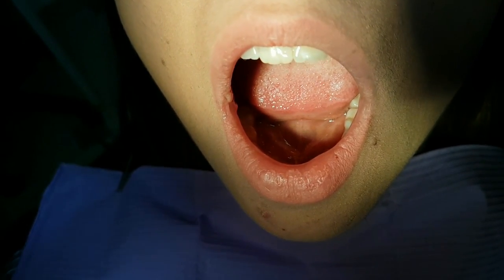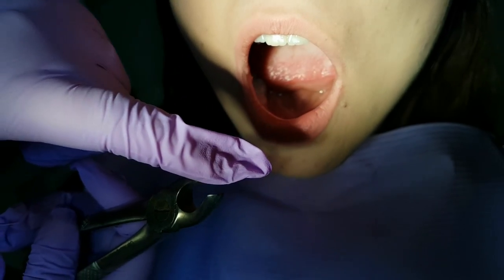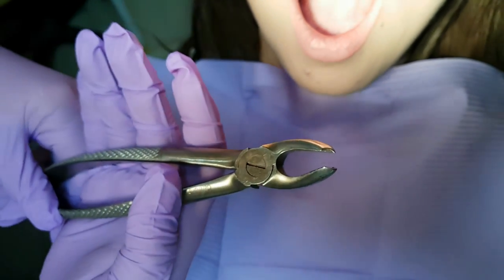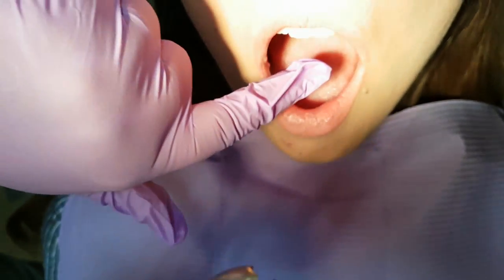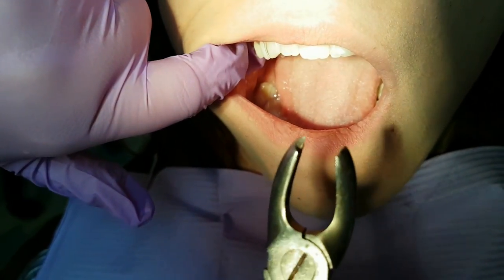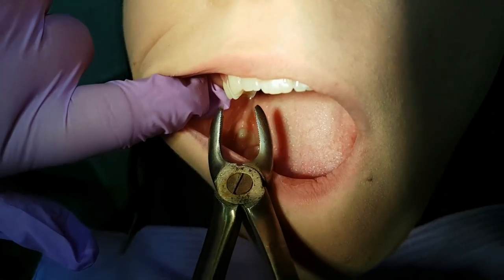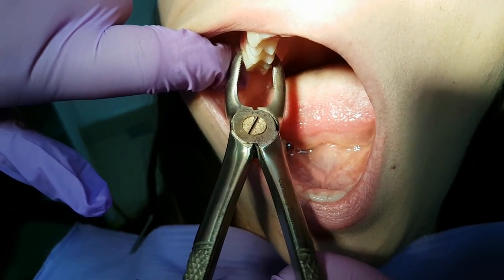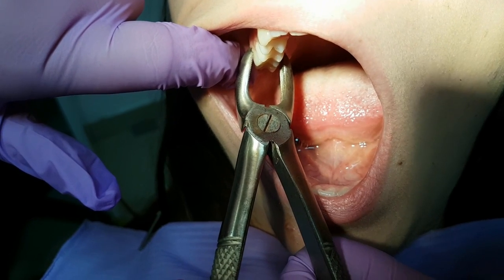Next we will show you how to use the molar forceps. In the video before we showed you that this forcep has a thorn on one of the working beaks. This thorn goes in the vestibular part of the teeth and in between the bifurcation of the roots.